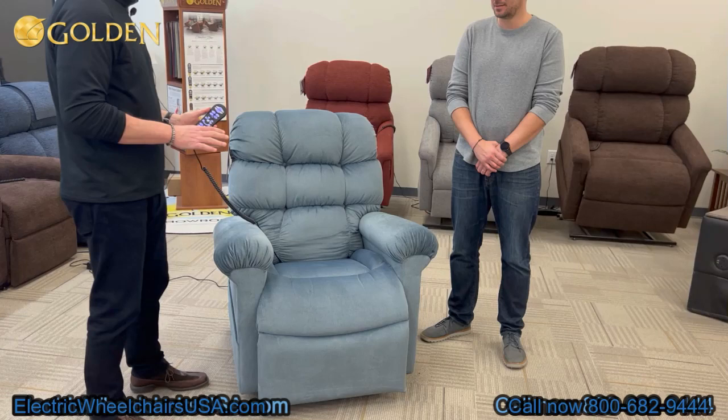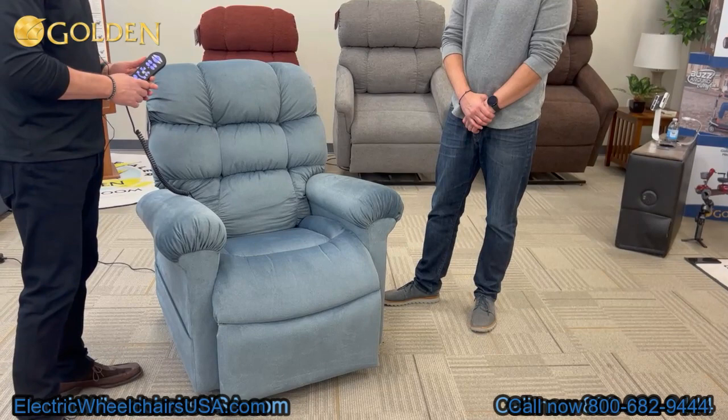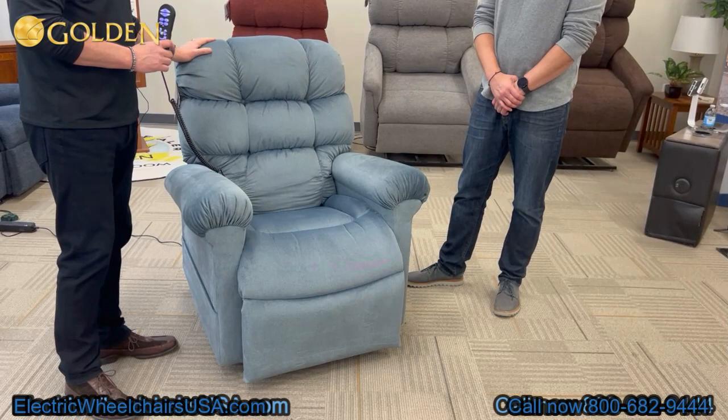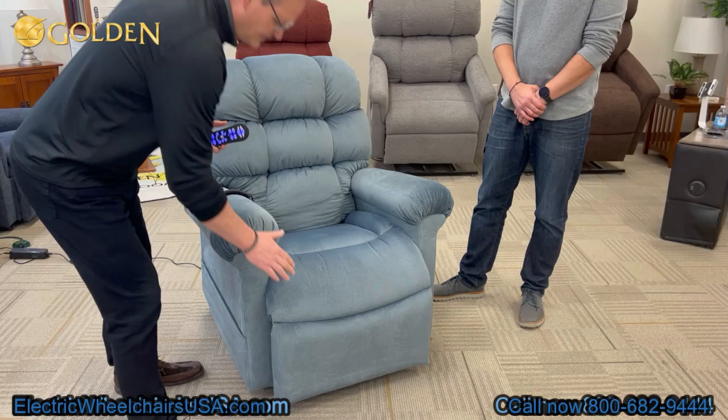This is the Cloud PR515 5-Zone configuration. The chair comes in small, medium, and medium-large — we're looking at the medium-large version now. The 2-Zone version with two motors is model number PR510. These chairs are available with upgrades such as deluxe heat massage and heat wave technology, which is a 3-Zone infrared heat system.